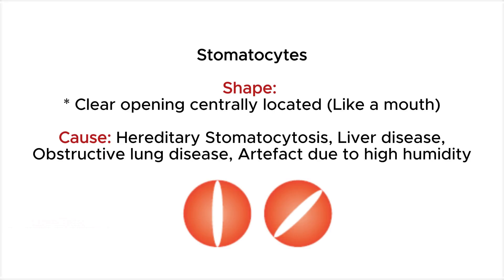Stomatocytes are erythrocytes with a clear opening located centrally in the cell with the shape of a mouth. This condition is seen in hereditary stomatocytosis, liver disease, and obstructive lung disease. It can also be an artifact due to high humidity which makes the smear dry slowly.